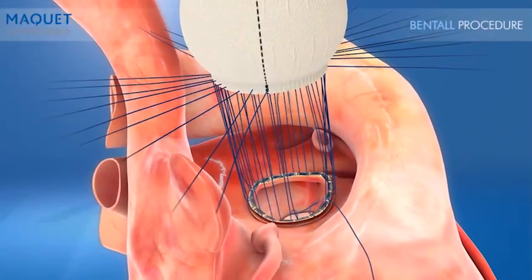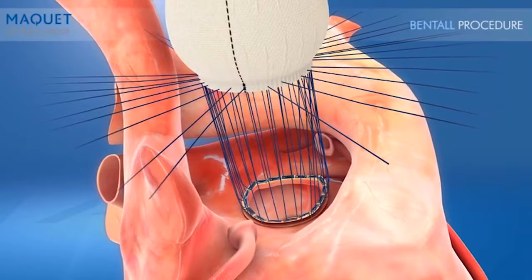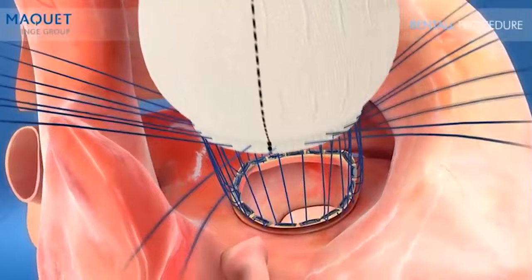The anatomically correct shape and uncrimped proximal end offer excellent handleability, making the sewing of the valve cuff to the graft easy and precise. Next, the sutures are drawn up and the valve and graft are parachuted down into position, and each interrupted pledget is tied off.